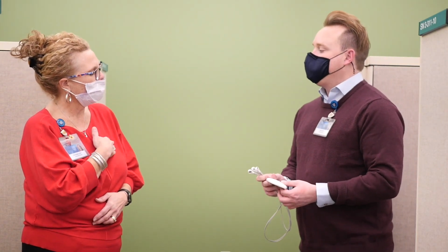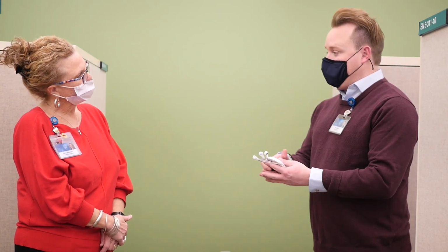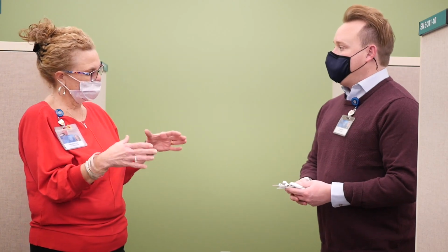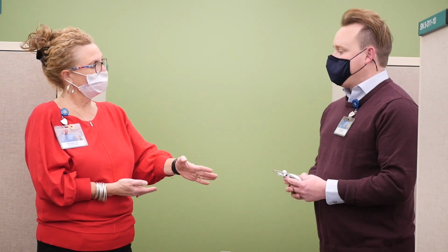The patches will come off over time, but we send them enough that they can just put it back on. This whole package, is it just mailed to them like an iPhone? More or less, we send it in a little case, and then we put it in a FedEx box, and then we send all the FedEx stuff with them. So all they do, when they're done, they put it all back in there.